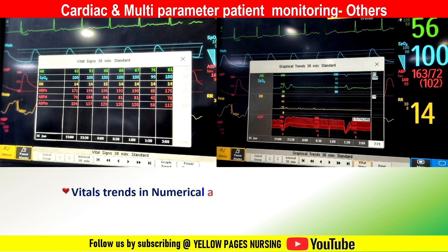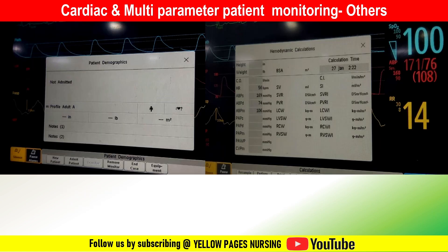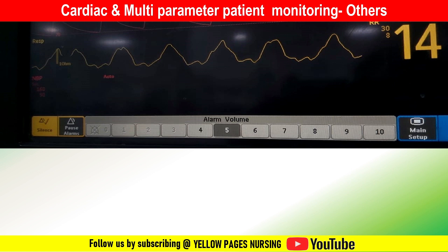The multi-parameter monitor has an option to check vital trends in numerical and graphical form and can be connected to a central monitor. An important feature is alarm volume, which can be adjusted. Alarms help in the early detection of changes or abnormalities in a patient's vital signs, allowing nurses to intervene promptly, prevent potential complications, and ensure patient safety.